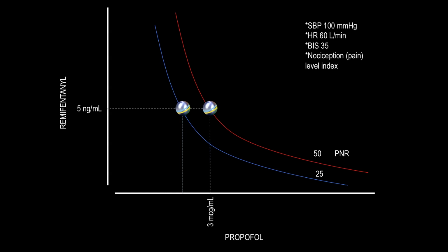A more accurate option, given the patient's clinical situation, would be to continue navigating on the same probability curve, with a lower propofol component, to be able to correct the bispectral index without taking the patient out of the plane. This would necessarily imply an adjustment to the remifentanil concentration.